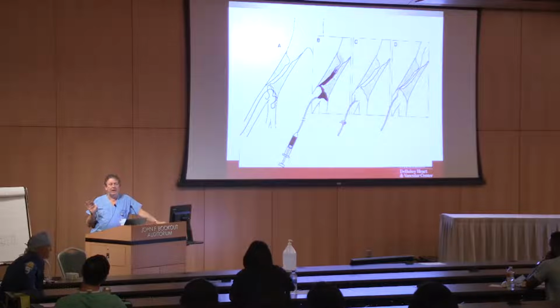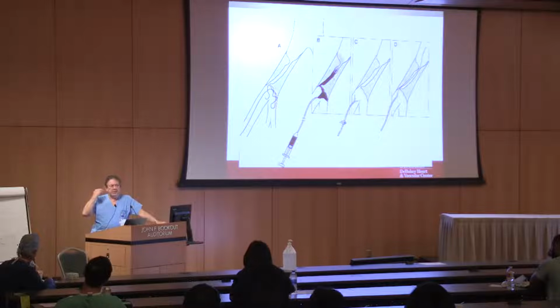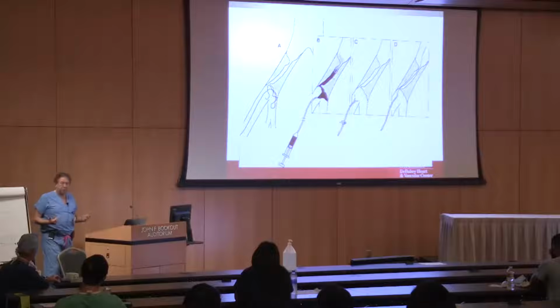It is the guidelines, but it doesn't make a lot of sense, because what's going to happen is that they're going to come back and say, Dr. Wright, you got too much radiation a month ago. You got to do something about it. Okay, kind of it tunes you in. But I think what we're moving to, and you're starting to see more, is real-time radiation sensors. Because I want to know now that I'm getting irradiated. And there are badges you can get, the red line, if you're standing too close, and immediately you see your name up there with a red bar coming across it, then you're going to step back.